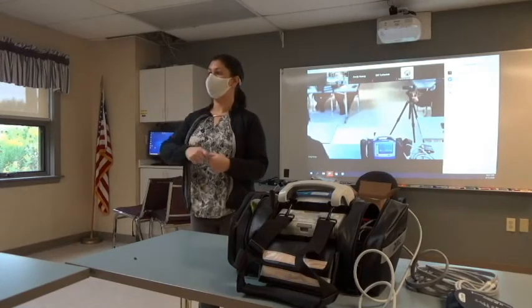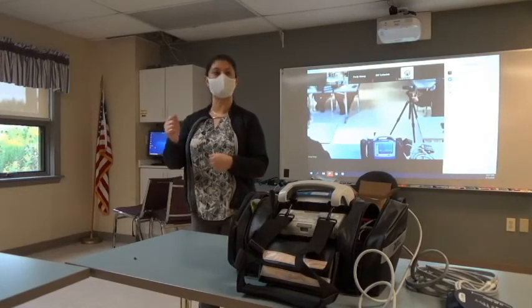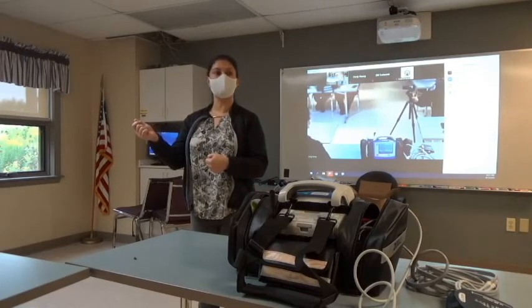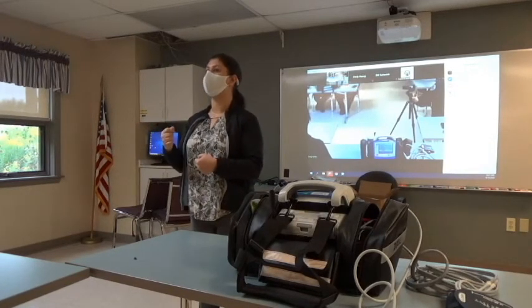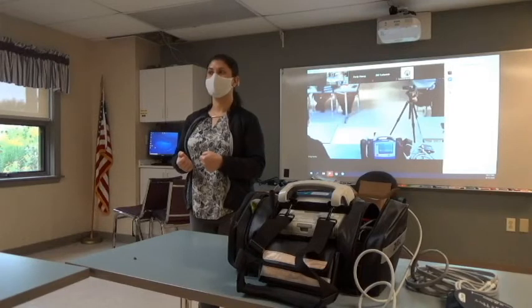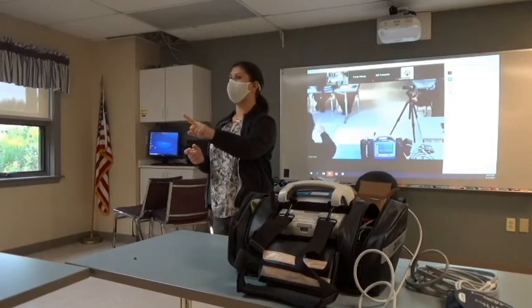So if you guys pull an electrode off, one of your four leads off right now, you can mimic that. So it's going to show that it's going to override in fixed mode so you don't lose capture. Pull it off again, Richie. Leave it on. If we had the pads on, it would show the rhythm. So someone will still call. Well, no, it will not.